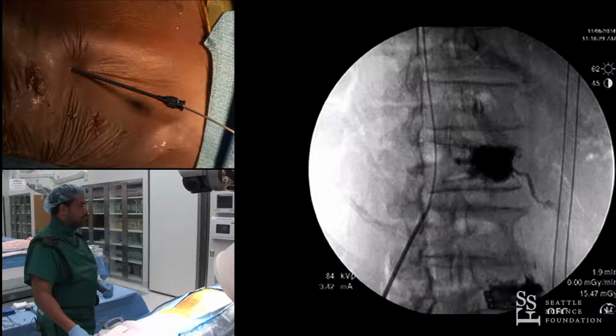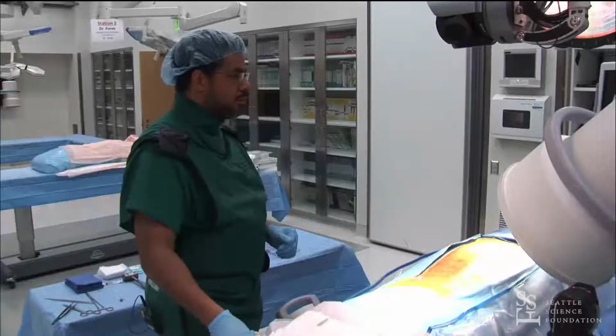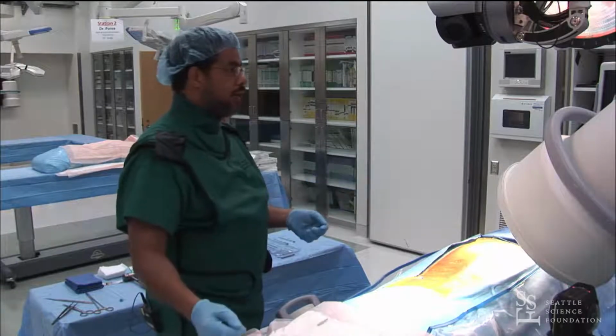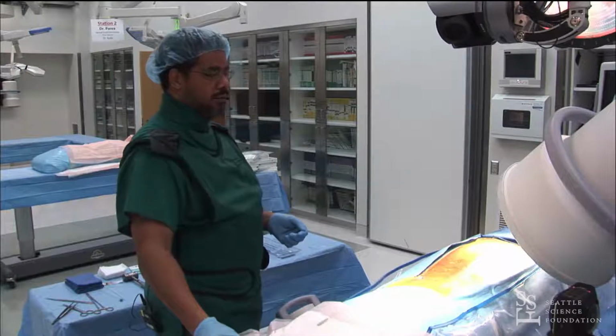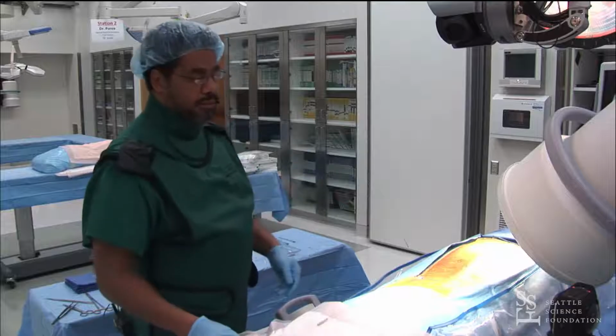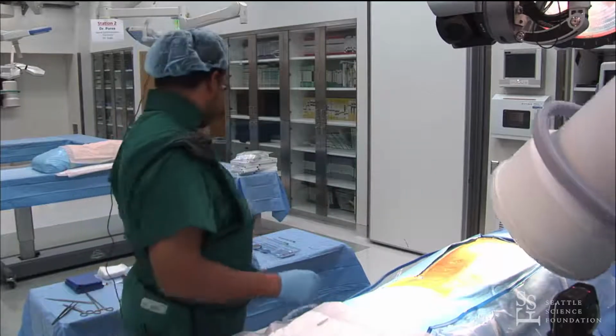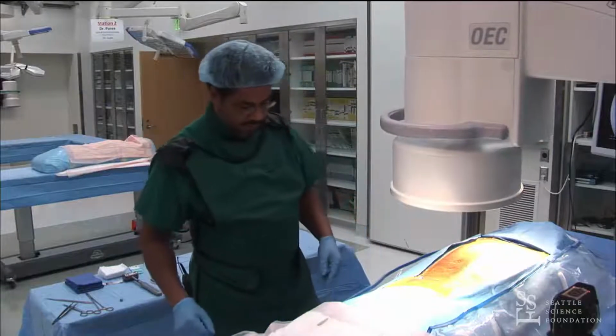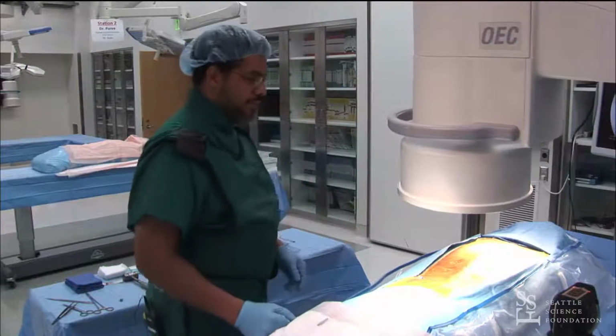Further questions from the audience? Is there a possible time to get a DRG stim trial done right now? If I have one. Yeah, can we get that underway for the audience? You worked through that so quickly that we have some extra time. I think it would be beneficial to our audience to see one done here.